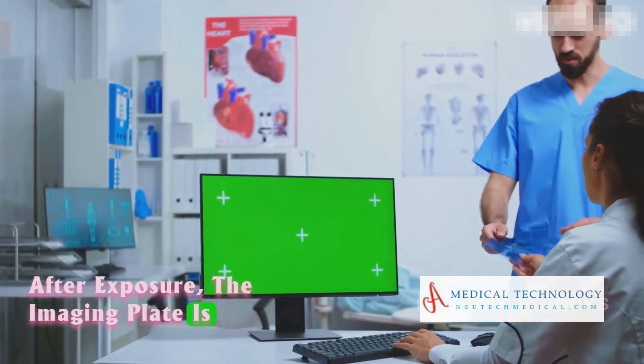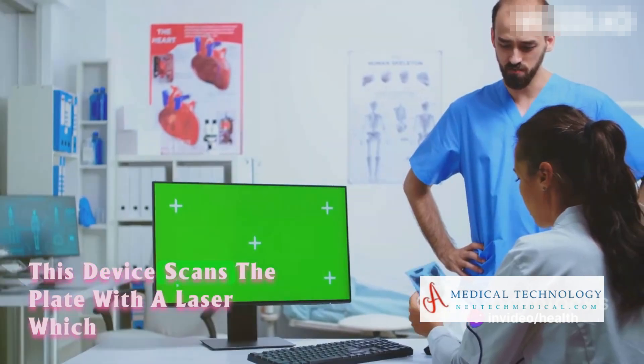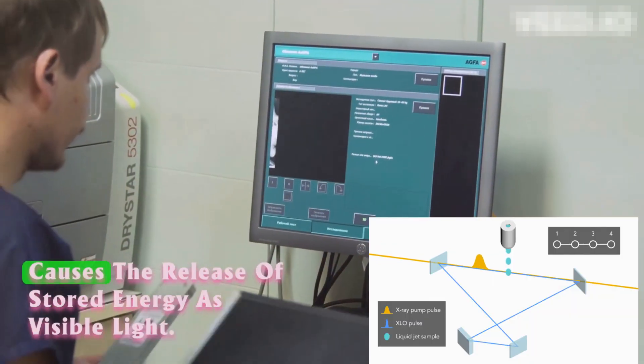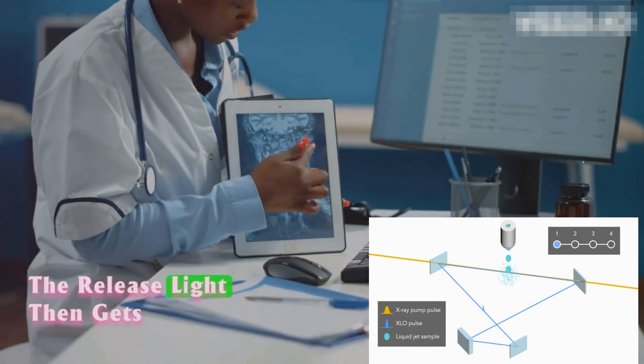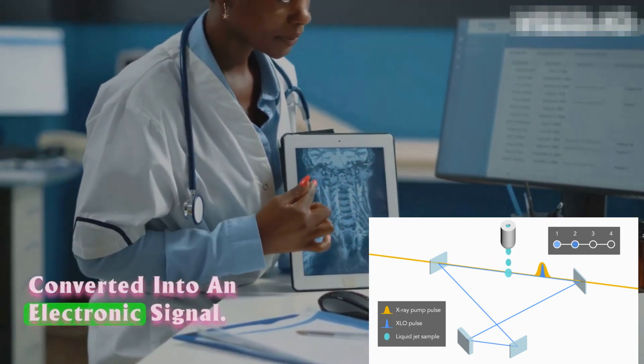After exposure, the imaging plate is processed in a CR reader. This device scans the plate with a laser, which causes the release of stored energy as visible light. The released light then gets converted into an electronic signal.